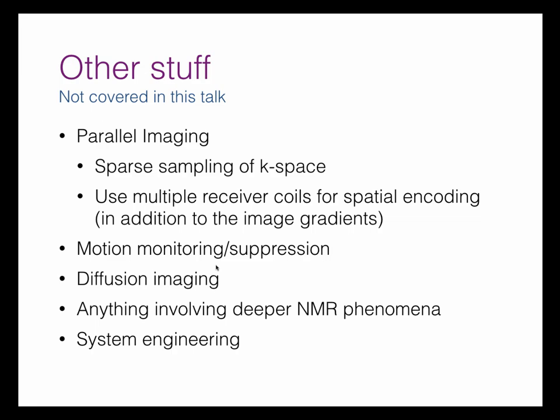If you've got real-time processing, you can compare those data to your previous scans used to make your image, and then either reject the data and reacquire it, or, if you need it in real time, make a motion correction applied back. That's fairly sophisticated and requires a fair amount of engineering, but it can be done.